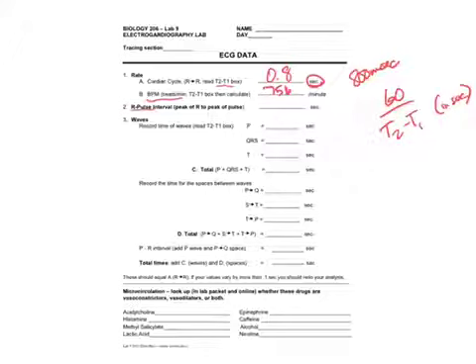The next thing, the R pulse interval, if we look at that, 0.235 seconds. So it seems pretty straightforward. Once you get to that right cardiac cycle and you get 2 cardiac cycles up, this is pretty much what you're going to follow. However, I'm going to give you a word of warning.